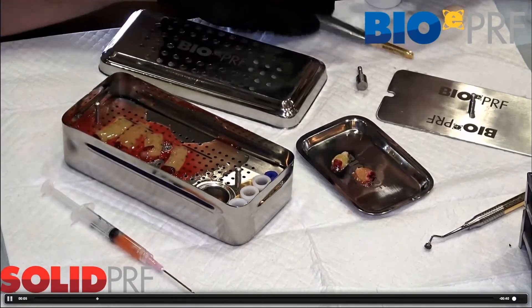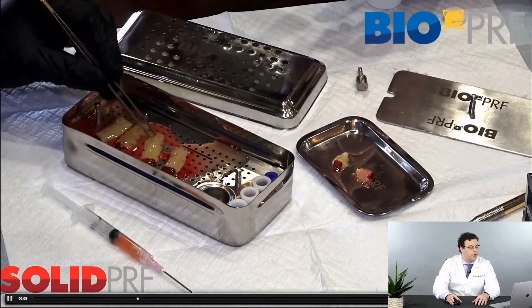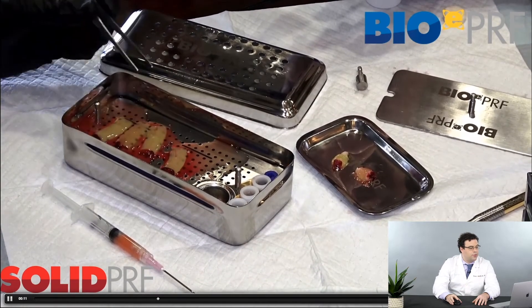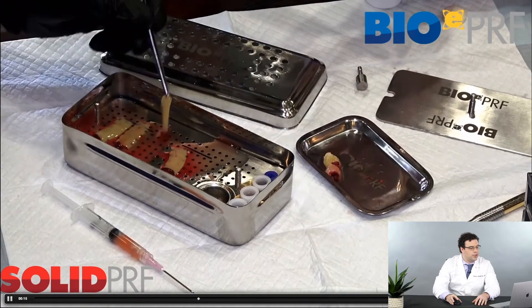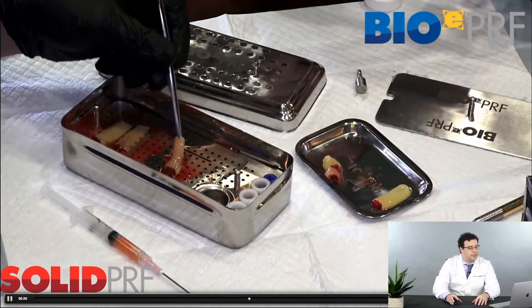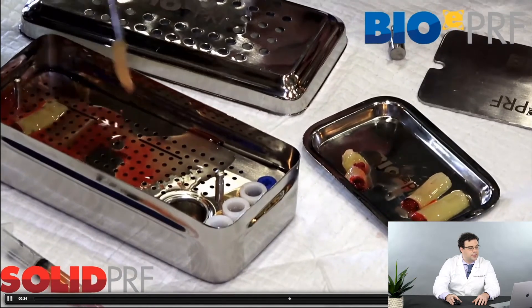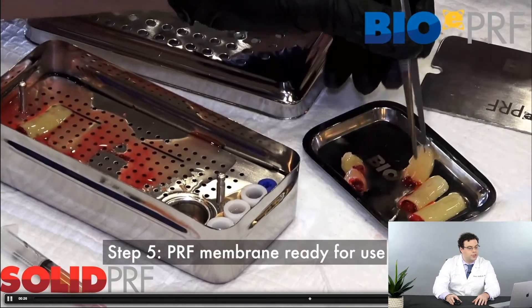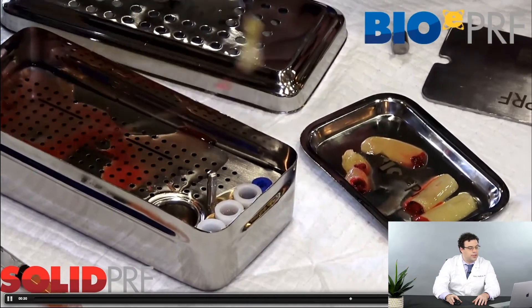Once that's done, the membranes are flattened and ready to use. I'll take a few out and place them on the tray so people can see what they look like. When you pull these, you can see they're typically one to two millimeters in thickness. This is what we'll utilize in future chapters in clinics when doing GBR procedures — these membranes will be laid flat over the healing sites.